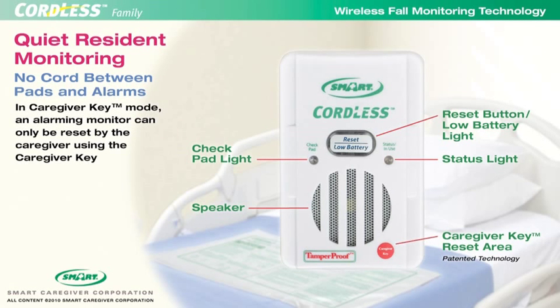Caregivers may make the monitor tamper-proof by switching it to caregiver key mode. In caregiver key mode, the reset button is disabled and only the caregiver can reset an alarming monitor with the caregiver key.